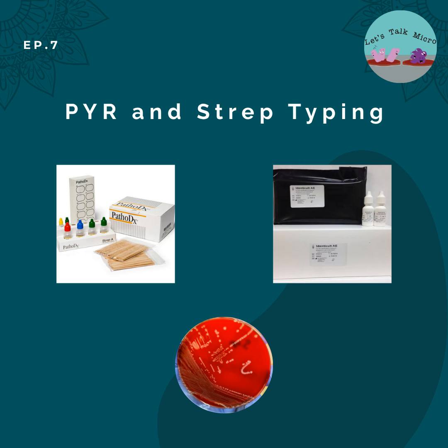Now, granted, with experience, depending on the source and the morphology, you know what you're looking for, so you can go ahead and test for the one you're looking for. But this is why you do your PYR first, because that's helpful as well. If you do PYR and it's positive, then you just test for A, right? Because you know that C, F, and G are PYR negative. And if your organism is PYR negative, then you test for your C, F, and G, but you don't have to test for your A.